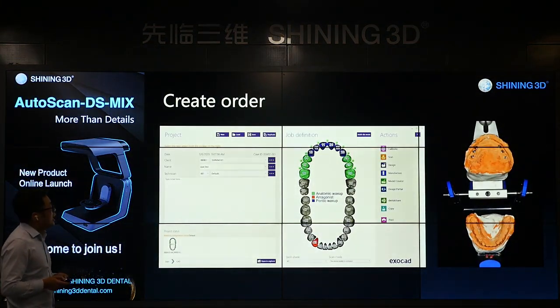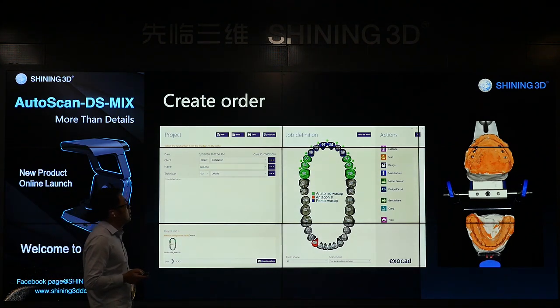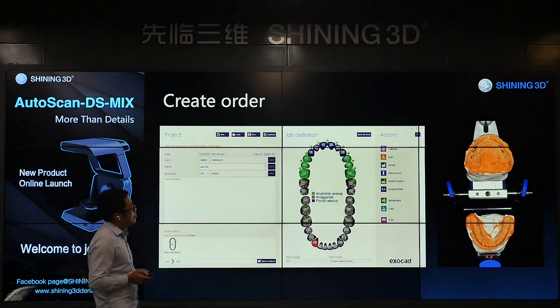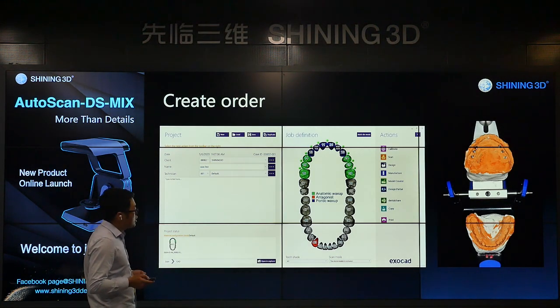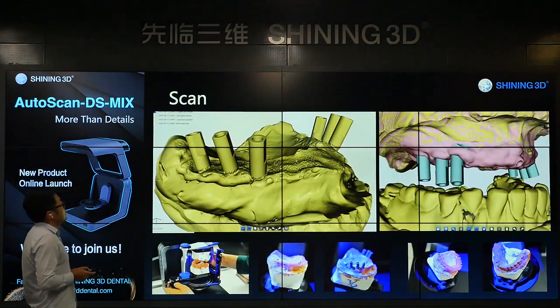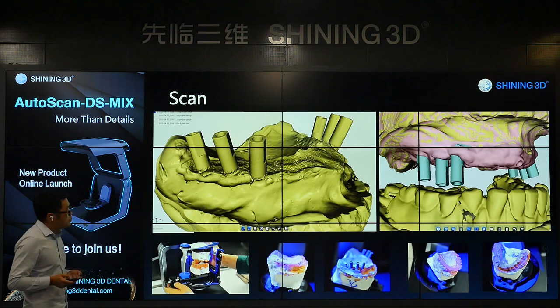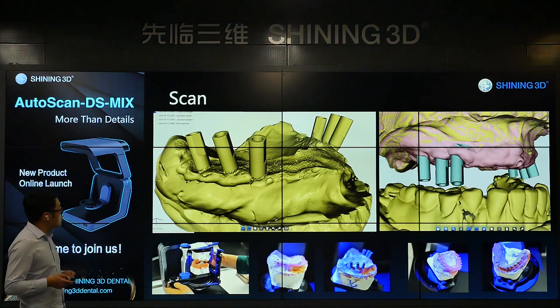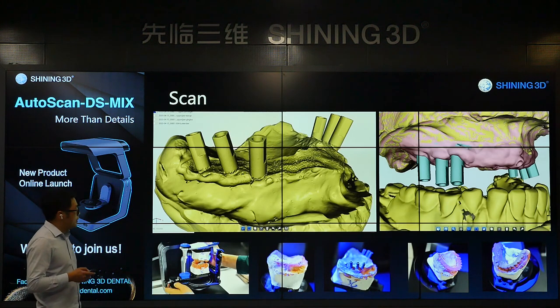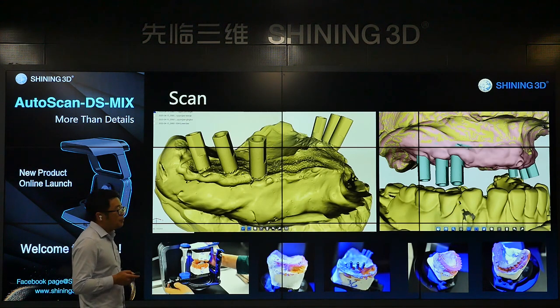First, we need to create the order for this case. 1-4 to 1-6, 2-4 to 2-6 is anatomic wax up. 1-3 to 2-3 is pontic wax up. 4-3 is antagonist. So this is the scan process. Now we can see the picture below. First, we need to scan the total jaw. Then gingiva, then scanbody, then the wax up bridge made by hand, then the antagonist.